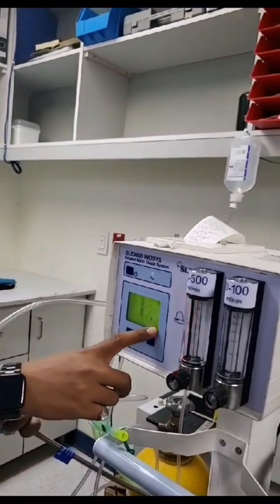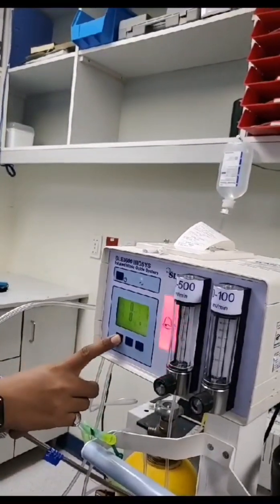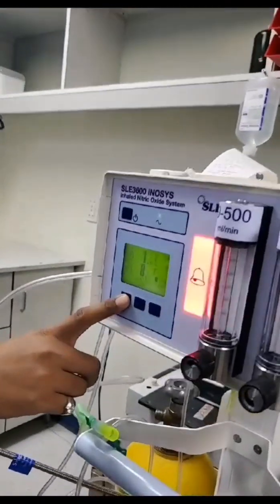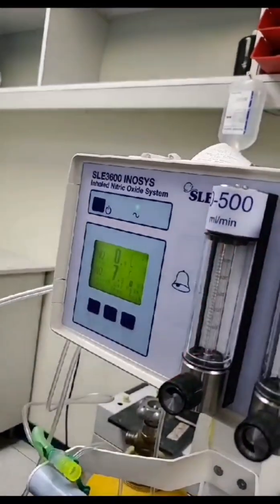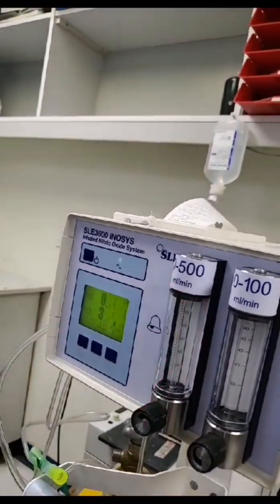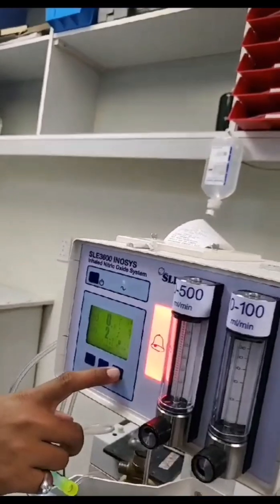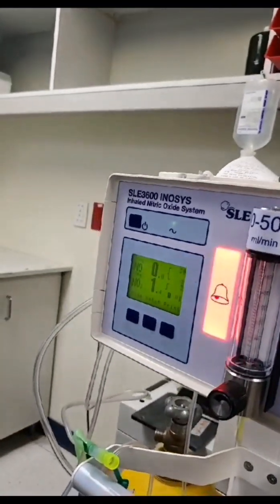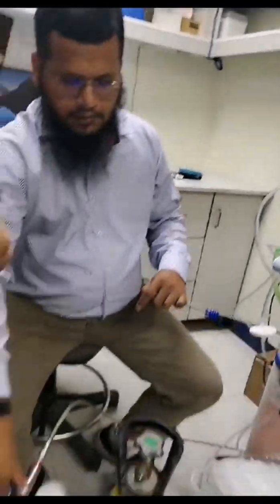So NO2 calibration is done. Continue. Yes. Calibration is done. Go exit. So wait until it comes to zero, then close the regulator.